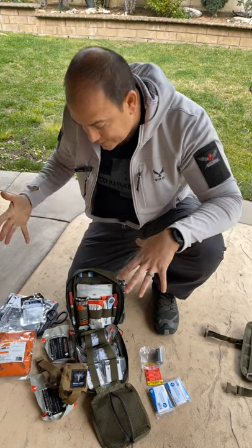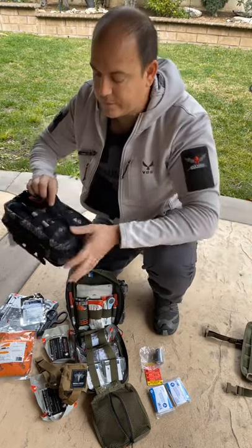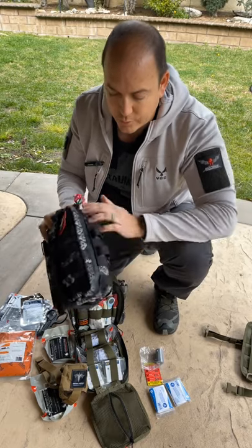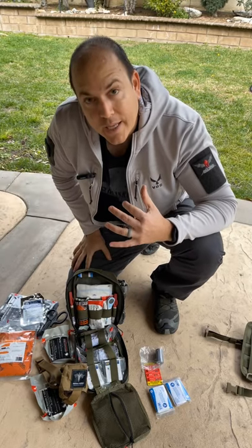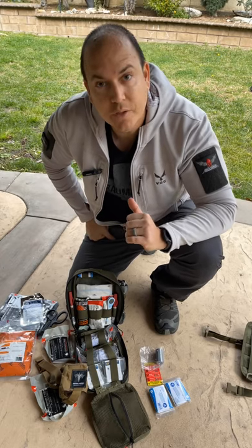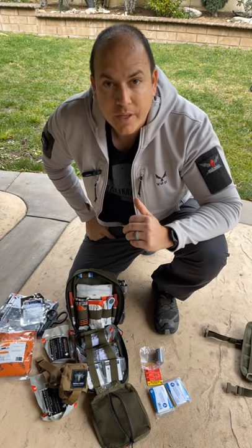This is our K9 Trauma Pack in the Ranger Green option. We also have it in our Virtus Camo — the Echo Camo — same exact bag, really durable, all waterproof zippers. These are the two color options we currently have. This pack is meant for the canine handler and the canine themselves, inspired by the working dog community. Our goal is that this will not only save human lives but also canine lives. Thanks for all the support, and as always, let's save lives together.